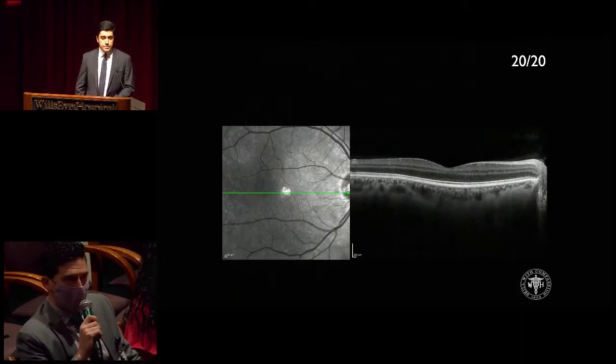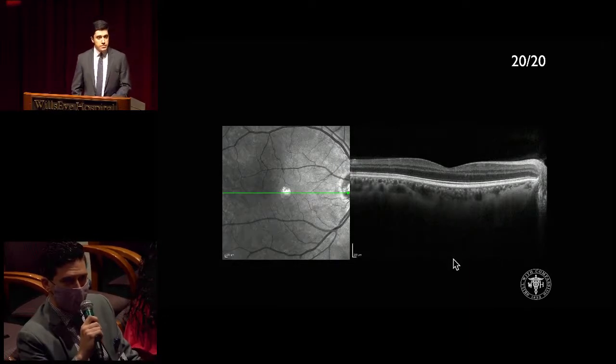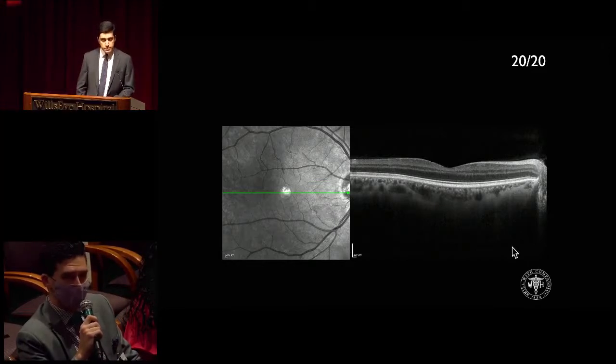This is an OCT horizontal raster scan through the right eye, again, the 20/20 seeing eye. Aside from a little bit of reflection artifact here on the IR, the image looks normal on en face. The OCT scan itself shows healthy appearing, relatively normal choroidal thickness. The outer retinal lamination patterns are intact throughout. The inner retinal lamination patterns are also of normal thickness and pattern here, and there is a healthy thickness to the retinal nerve fiber layer in this eye, essentially a normal scan.